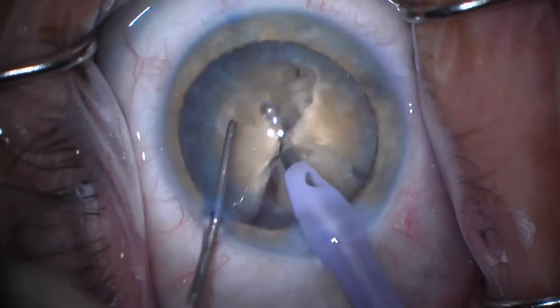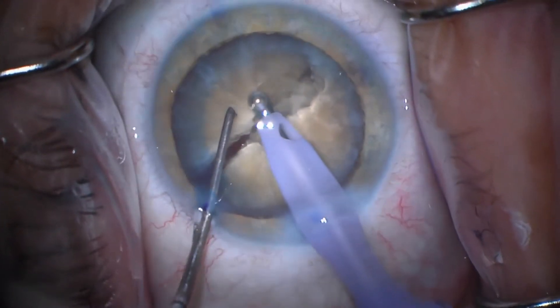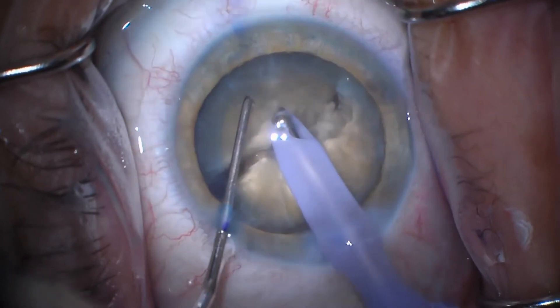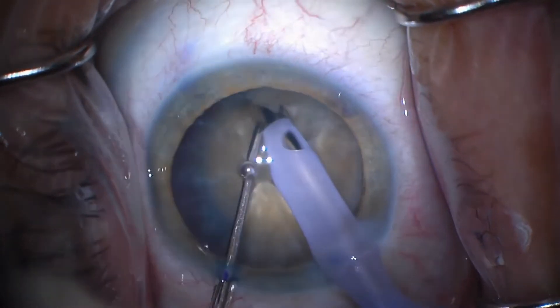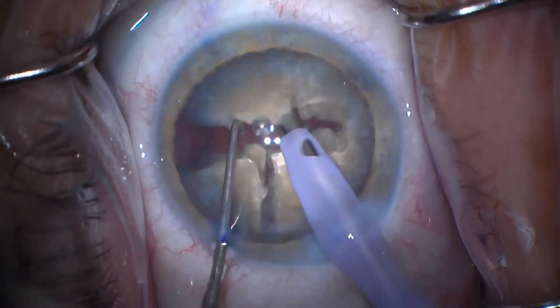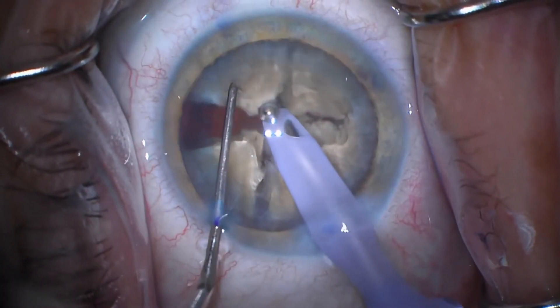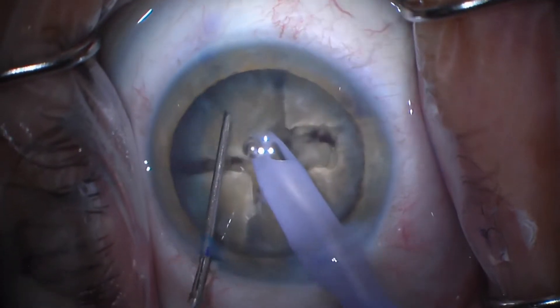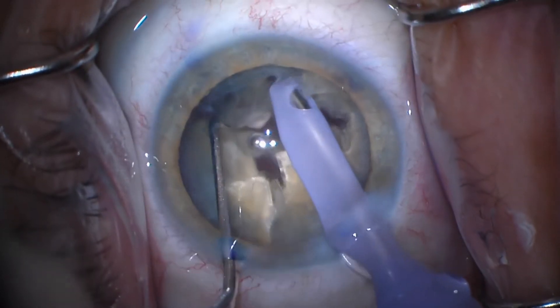Now this other piece I'm going to break into three pieces. I'm going to embed here — I'm using a burst mode. I'm embedding in, bursting. I'm just holding on position two and then I'm chopping it with the chopper. Most of the work is really done with this vertical chopper on the left. It's a side-bell chopper. Now I'm going to break this into final pieces, so we've got it in five pieces.